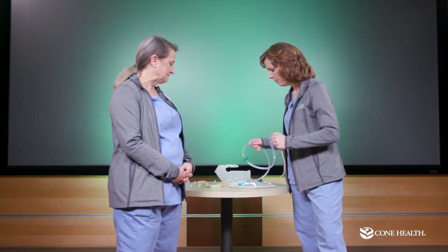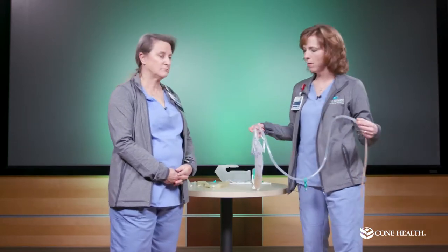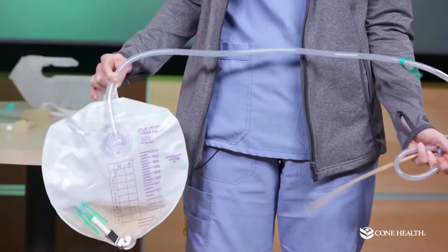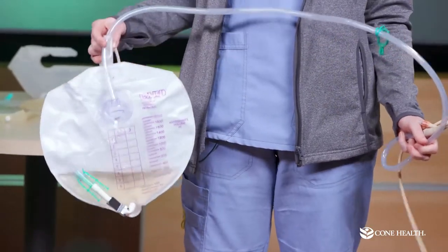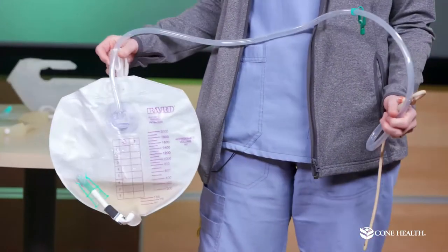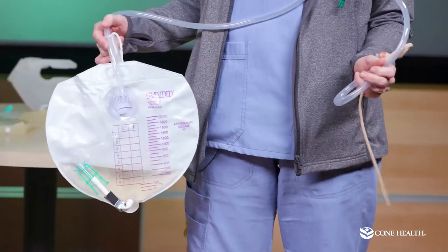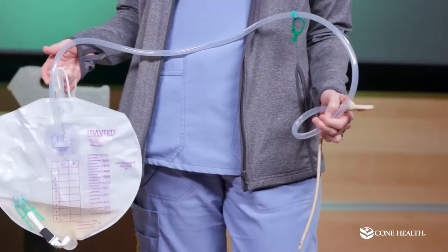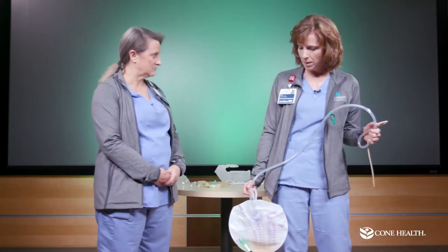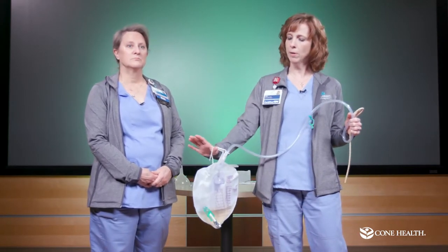This large bag is the one you'll come back from the OR with. It needs to be emptied at least every eight hours when you're home. You'll wear this one most often and always use it at night because it holds more. It's okay to get this bag wet in the shower — just towel dry it off afterwards. Make sure it stays below the level of your hips, since it's a gravity-driven system. When walking, keep it down to your side; when lying or sitting, always keep it below the level of your bladder.